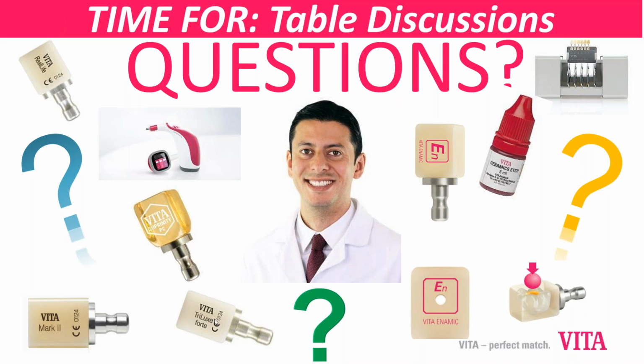I want to have centric points of occlusion in the posterior teeth that are actually oriented to those posterior teeth to take that heavy load. And then I want to have softer contacts, same as I do without the night guard, with the night guard, and a very nice, soft, let's say, palatine surface of the night guard. So if there are any protrusive movements, there's a mutually protected occlusion where we are not having interference in the posterior teeth. Not a very steep anterior guidance either, that could be stressful for the veneers or even for the teeth.